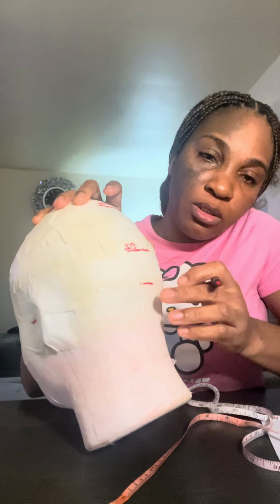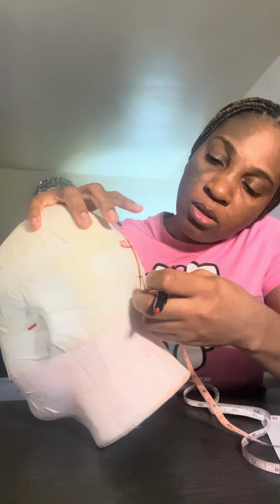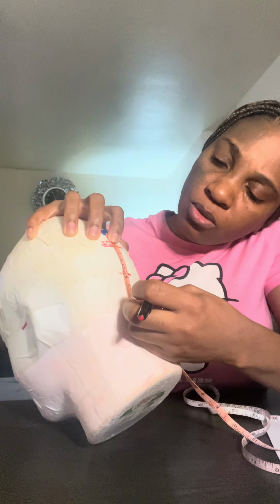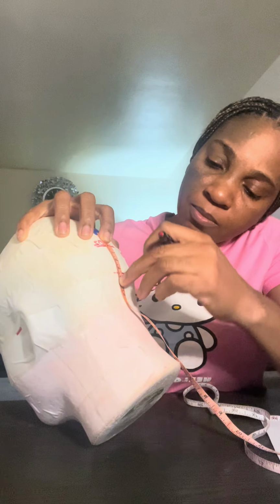And from my OZ down to my Inion, you want to be sure you put your 0 mark on the OZ, going down 10% to the Inion. So that's the sagittal measurements.